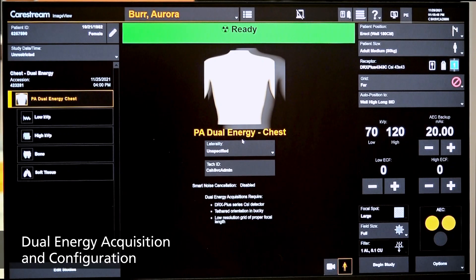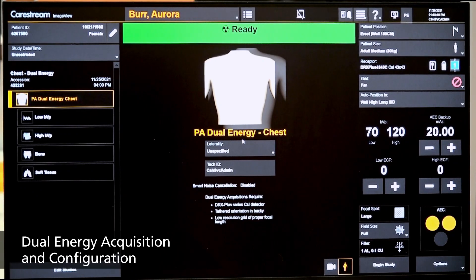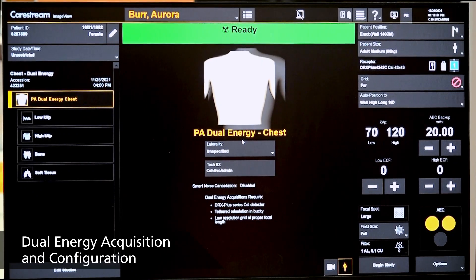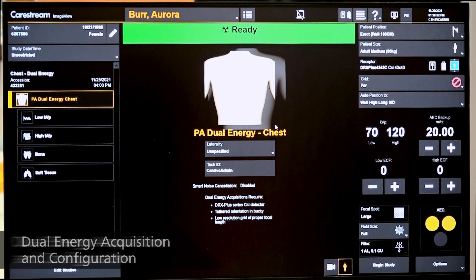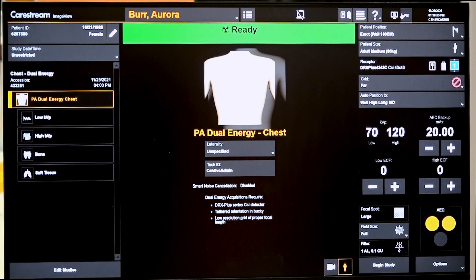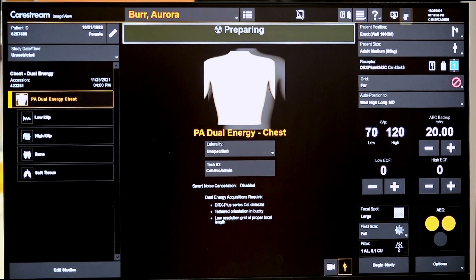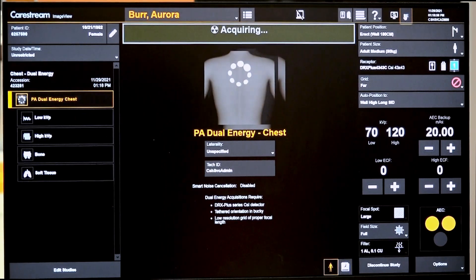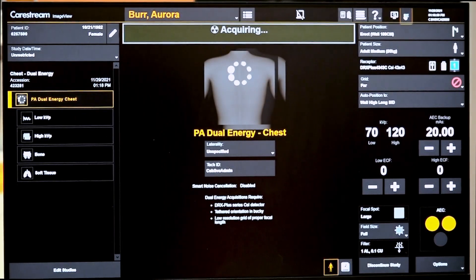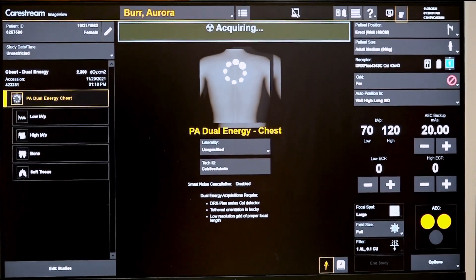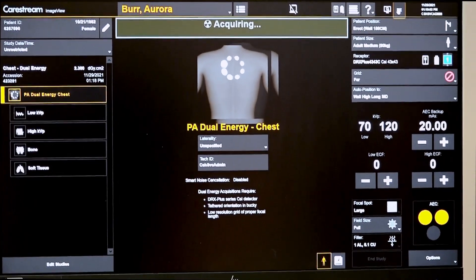I'm going to show a dual energy acquisition on the image view console, so we'll create a simulated acquisition here. What we do is acquire two images: a low energy and a high energy shot.